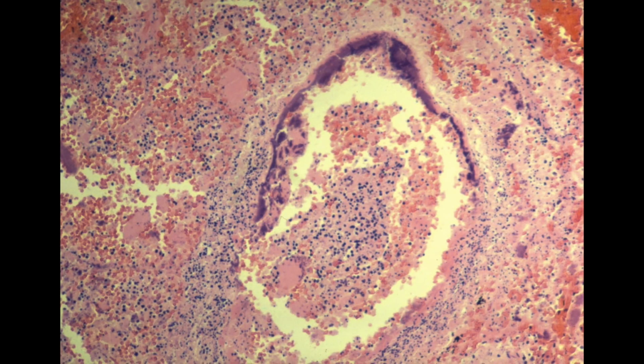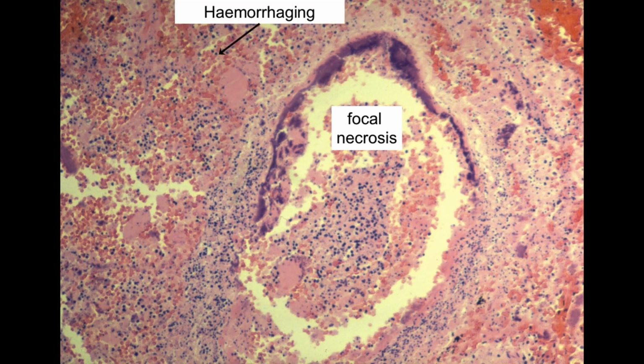At a higher magnification, we examine the abscess in more detail, and we can notice focal necrosis with a central necrotic area in the middle of the tissue that may have once been a bronchiole. Within the tissue, we can see evidence of hemorrhaging and fragmented nuclei. Importantly, there are no live cells left in this tissue, nor any of the original tissue organization.